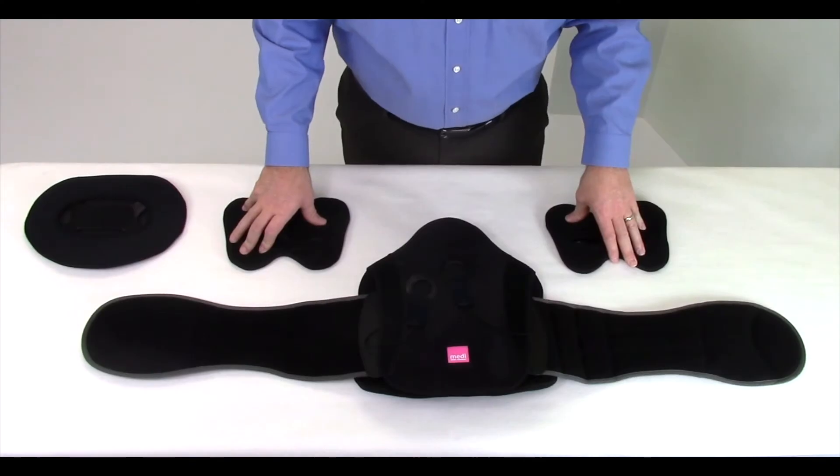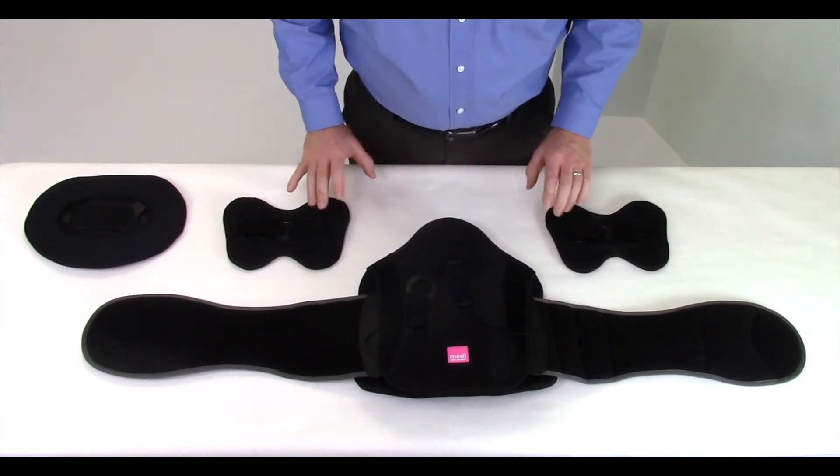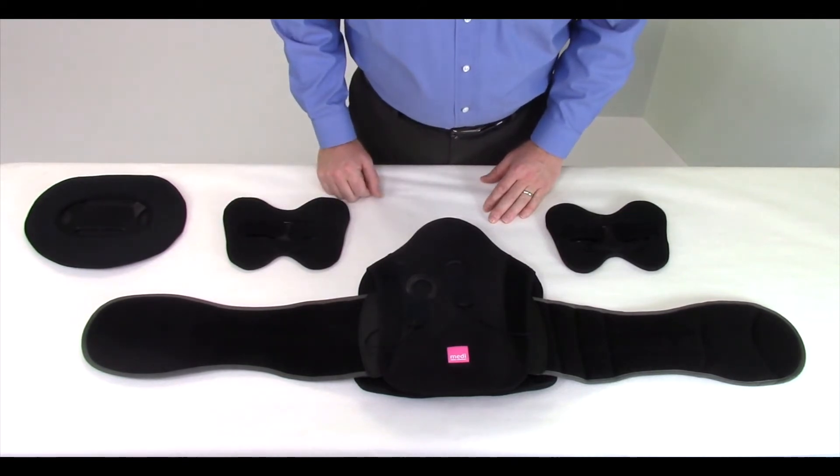If you're wearing the LUMBAR 637, there are two additional side panels that will need to be applied to the side wrap panels. These additional panels are shaped like a W and are included with your LUMBAR 637 brace.